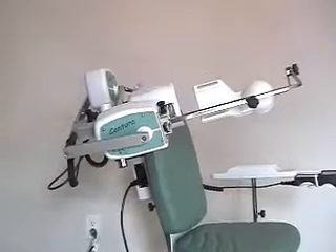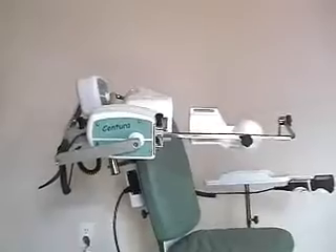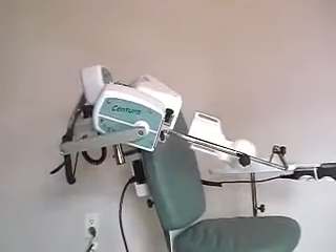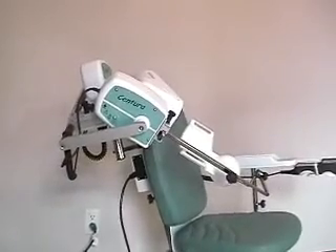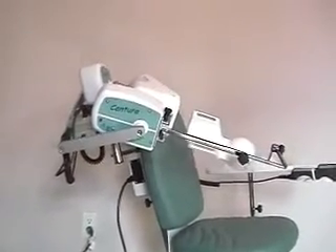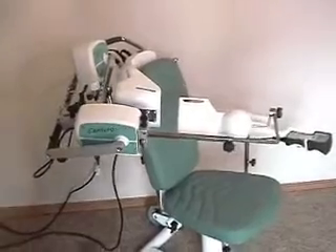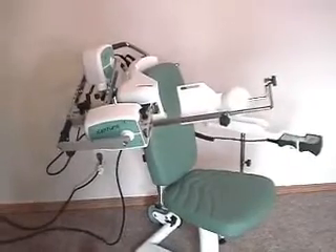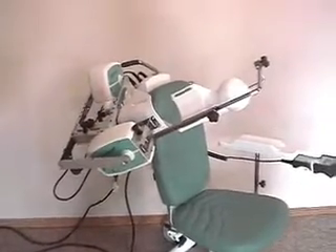Here we now have just the second motor, M2, doing rotation only with no ab or adduction occurring. Just as you saw, we can do ab and adduction with the arm held in any particular degree of rotation internally or externally. You can also put the first motor at any given point in the abduction range, stop it there, and then begin just rotation — internal or external — as we are doing now. You can see abduction is held in place with the first motor and the second motor is the only one showing any motion.